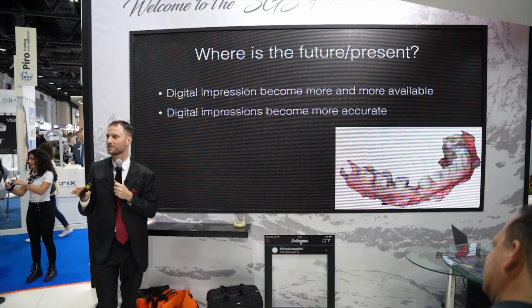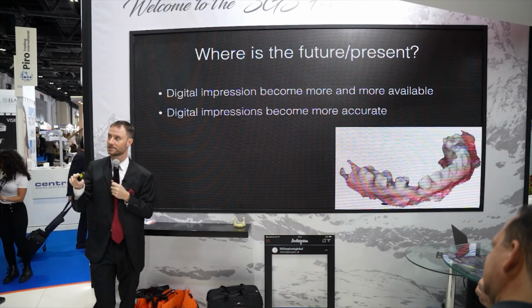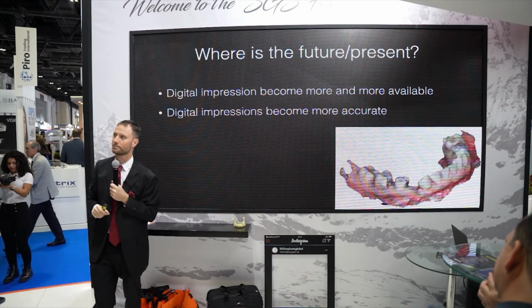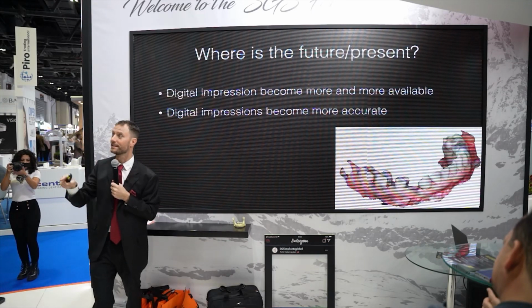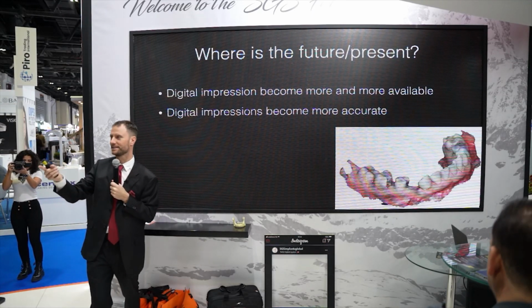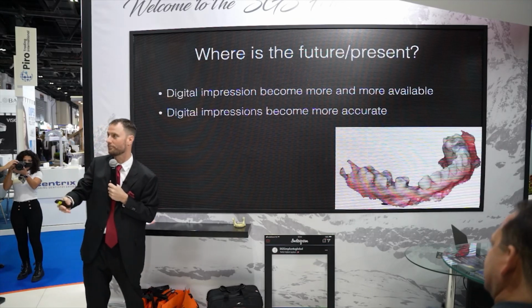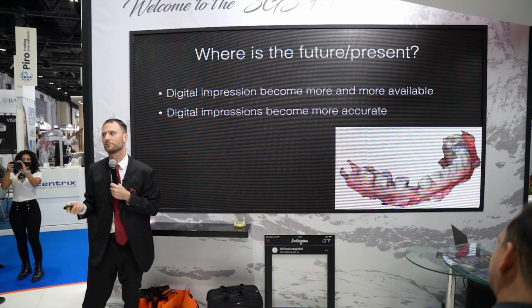That's my problem. So it is the future, but for that you need to train a dentist to use that as long as he's been trained for his regular impression. How many years have you been doing impressions? 20 years. Okay, call me in 20 years. Are you good in the same way with the digitals? But now training half a year will never be that good. Okay, maybe not 20, but in 5 to 10 years.